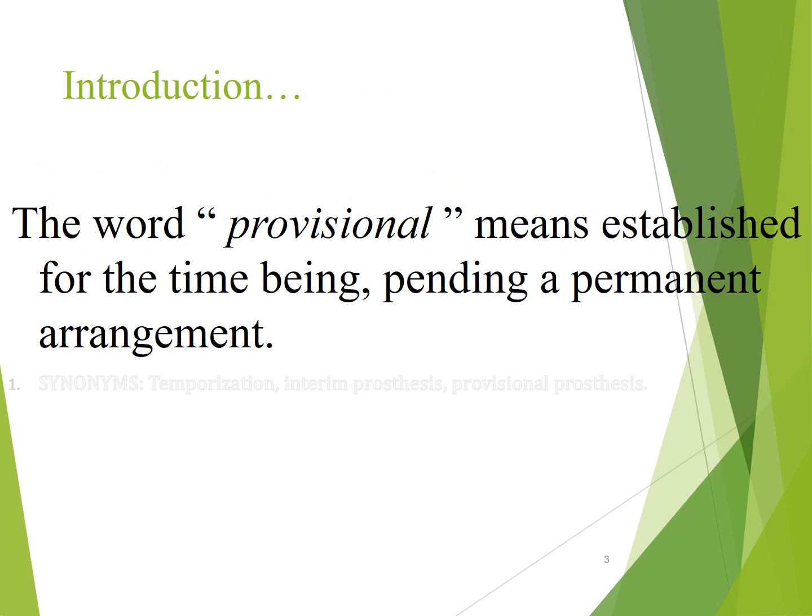So coming to the introduction, the word provisional. That means for the time being, pending a permanent arrangement. So, the synonyms of the word provisional are temporization, interim prosthesis, and provisional prosthesis.